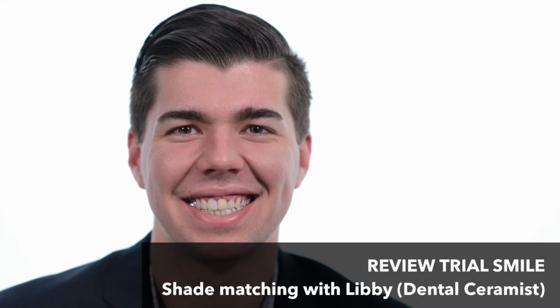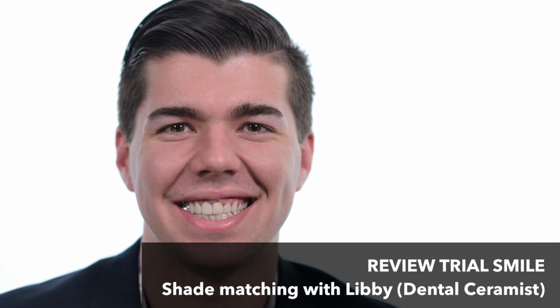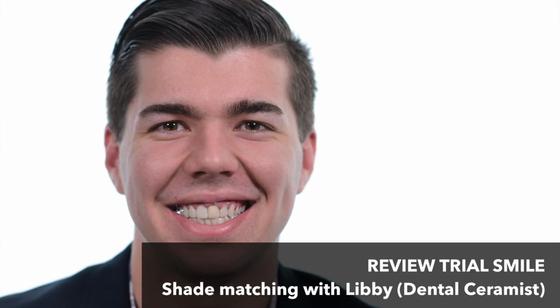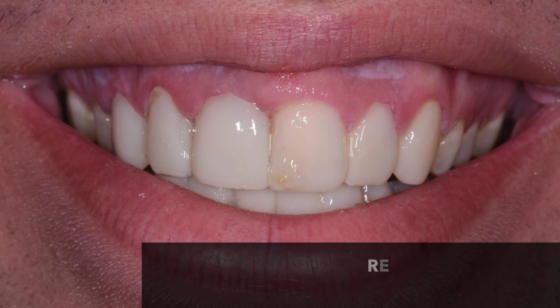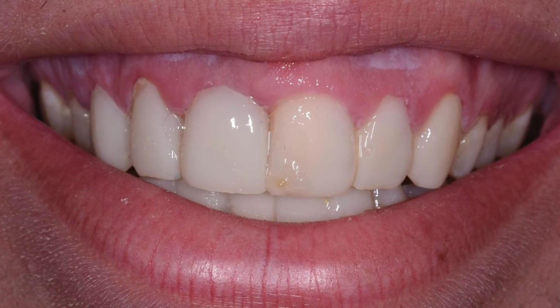So again, one of the most important things is to review this when his lip's not numb, of course, and again getting Libby, one of the ceramists, to come up and do what we call a shade matching to really get the color of the teeth correct. This is a close-up now of the trial smile, and we're still refining this and making sure that this is okay. And that's a photo of his trial smile there.